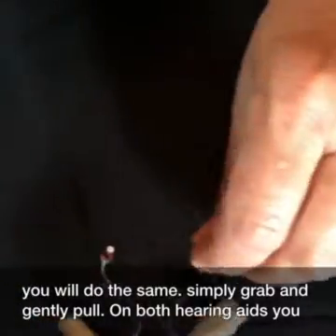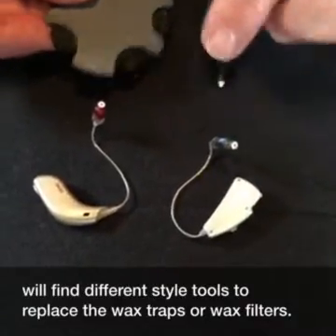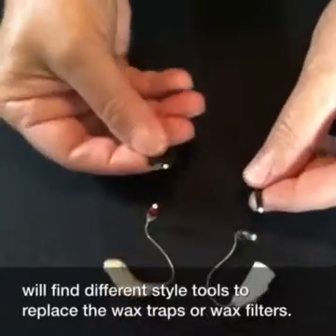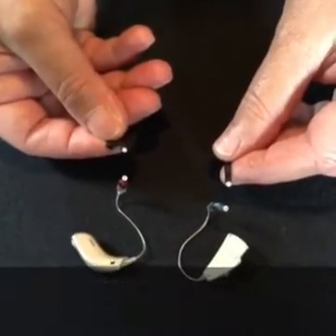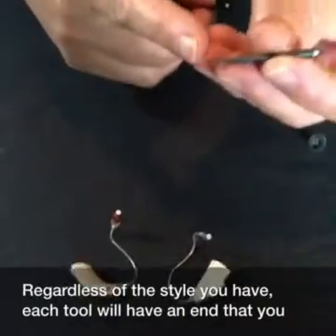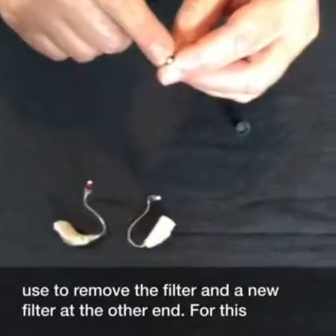On both hearing aids, you will find different style tools to replace the wax traps or wax filters. Regardless of the style you have, each tool will have an end that you use to remove the filter and a new filter at the other end.